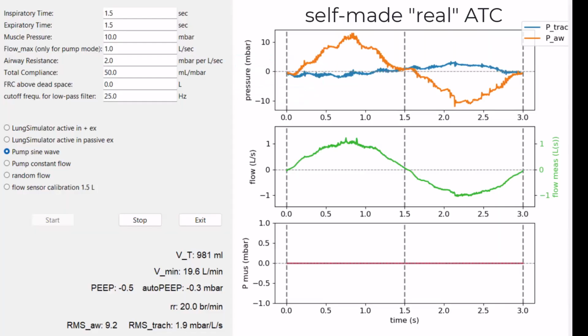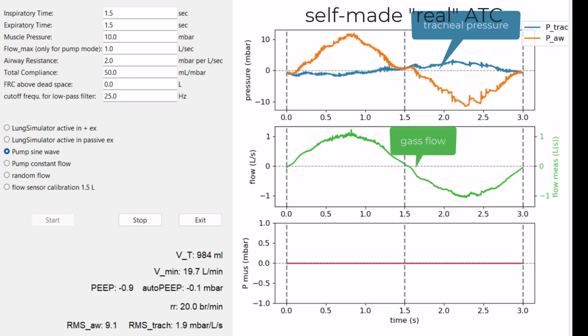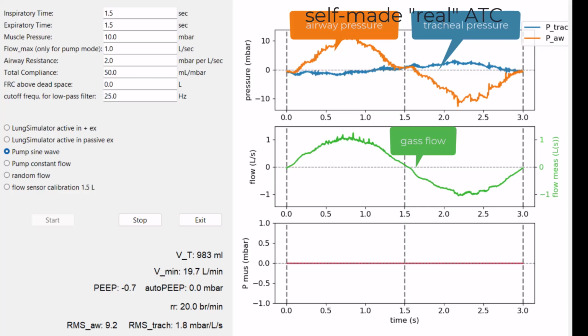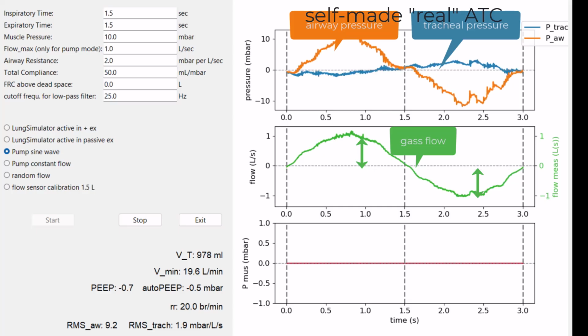This is now the screenshot from our lung simulator. The top panel shows the tracheal pressure in blue, airway pressure in orange. The middle panel, the flow pattern. It's a sinusoidal flow with a peak of 1 liter per second in inspiration and expiration.